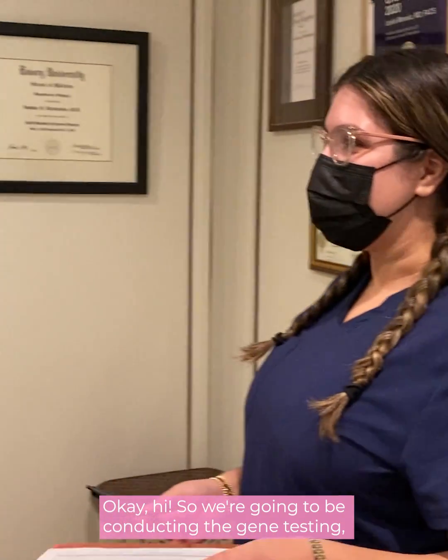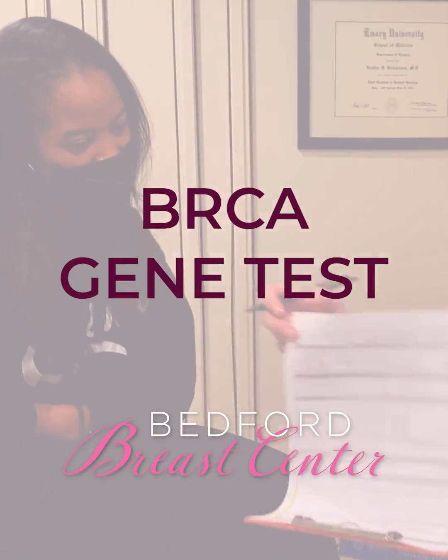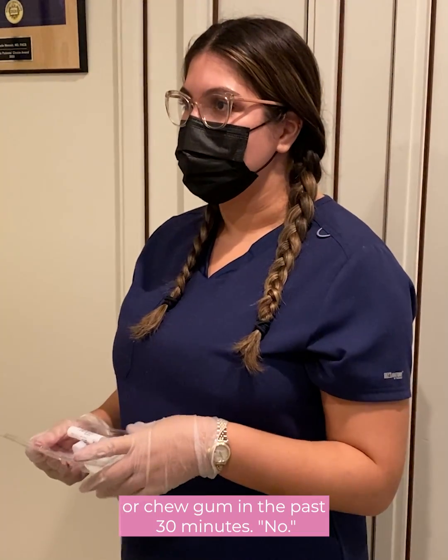Hi! So we're going to be conducting the gene testing. Just confirmed that you haven't eaten, drank water, or chewed gum in the past 30 minutes.